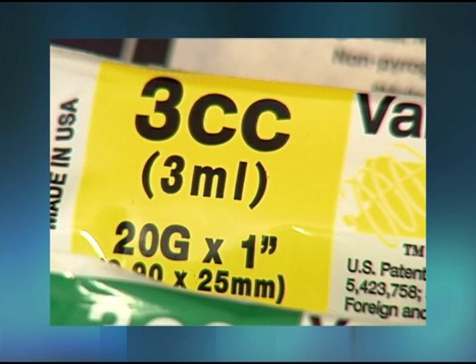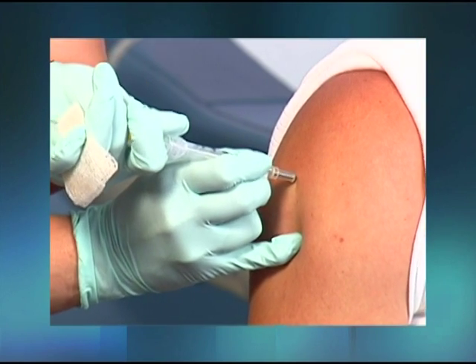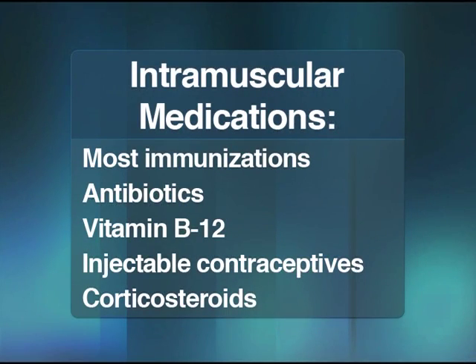The medical assistant is often responsible for administering intramuscular injections in the medical office. Medications that are administered through the IM route include most immunizations, antibiotics, vitamin B12, and injectable contraceptives and corticosteroids.